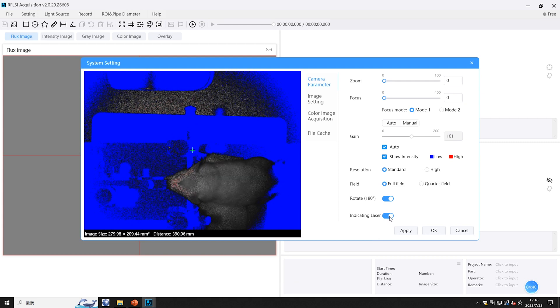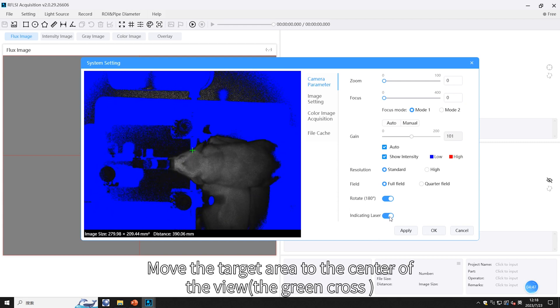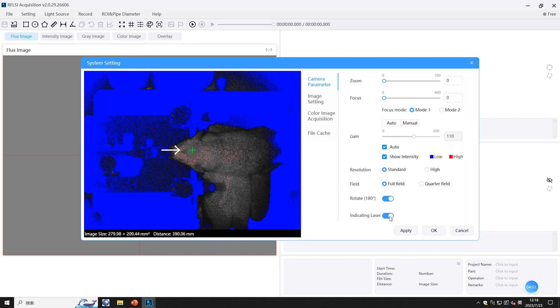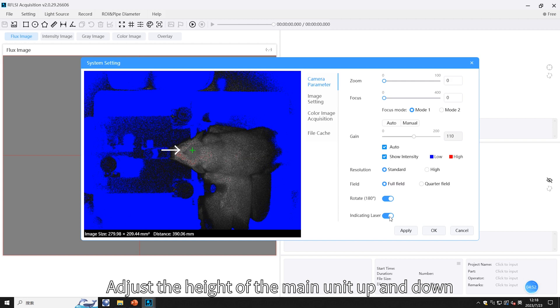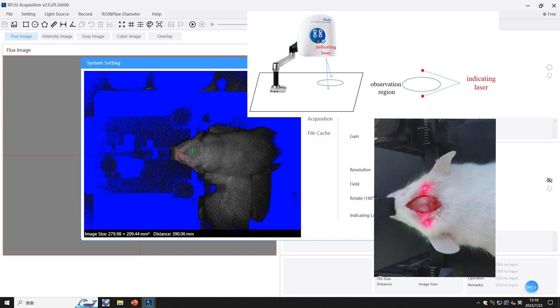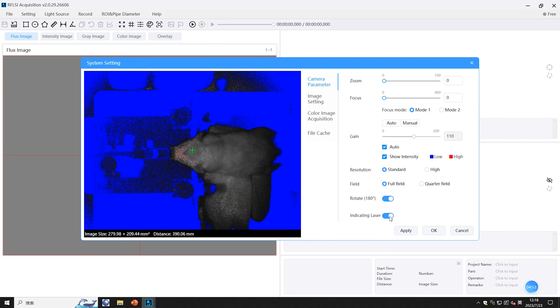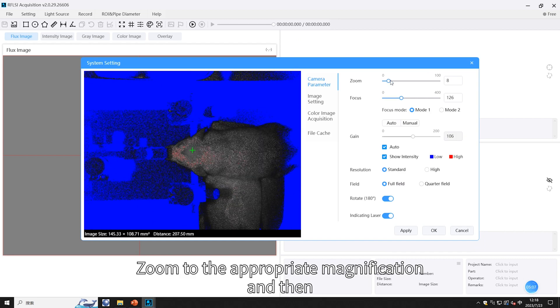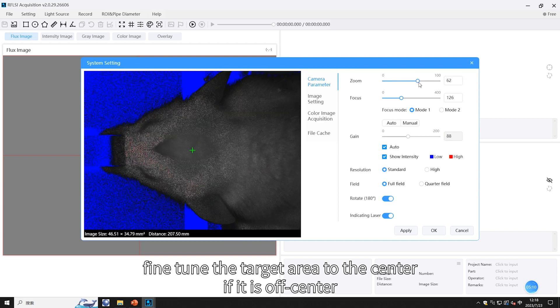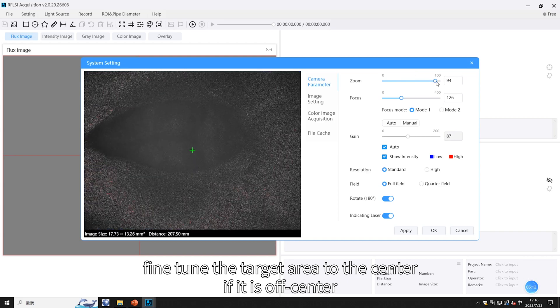Click on Settings > System Settings. In Camera Parameters, click to turn on the indicator laser and move the target area to the center of the view at the green cross. Adjust the height of the main unit up and down until the target area is in the middle of the two indicating lasers. Zoom to the appropriate magnification and fine-tune the target area to the center if it is off-center.